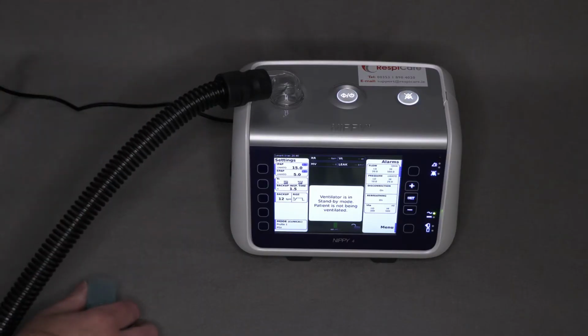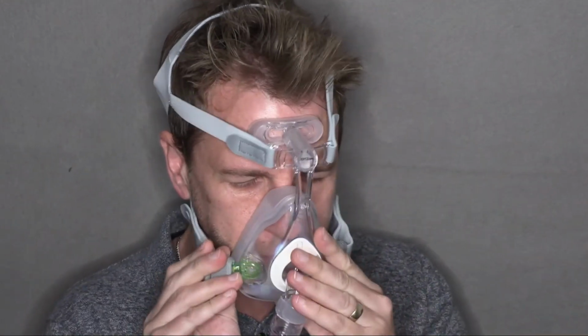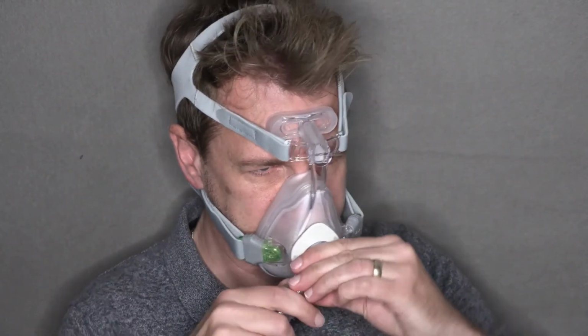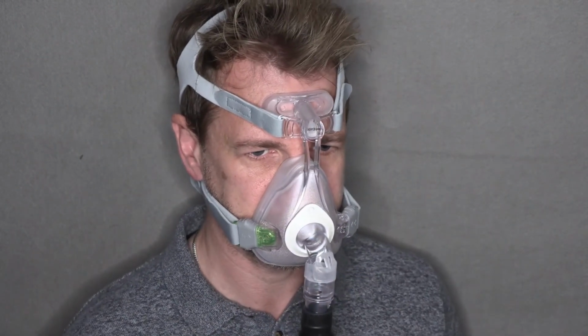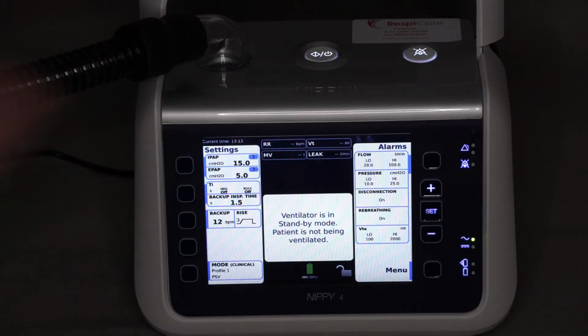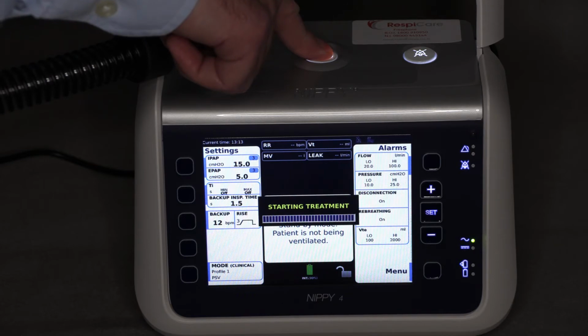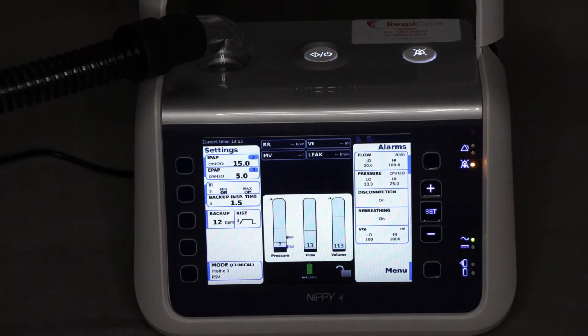Disconnect the mask from the end of the breathing tube and fit the mask onto the face, ensuring that it's secure and comfortable. Just before turning on the ventilator, connect the breathing tube to the mask. Turn on the ventilator by pressing and holding the power button until the progress bar goes all the way across the screen. Once therapy has started, Nippy 4 will immediately start blowing air down the breathing tube into the mask.